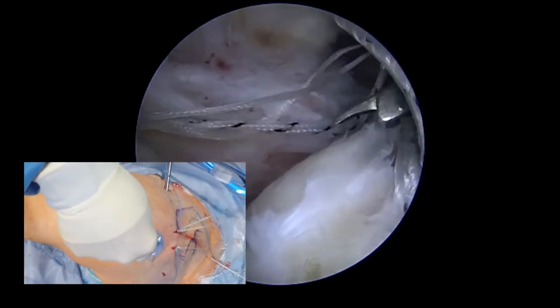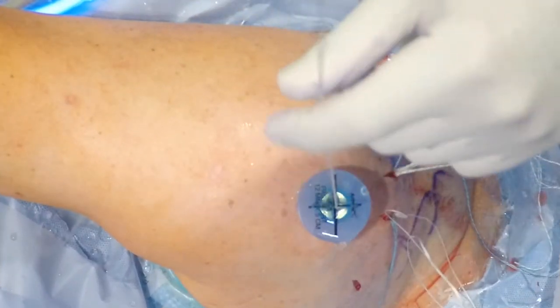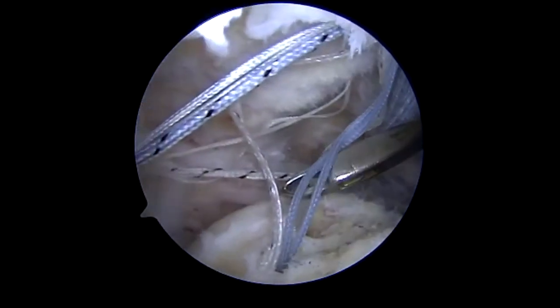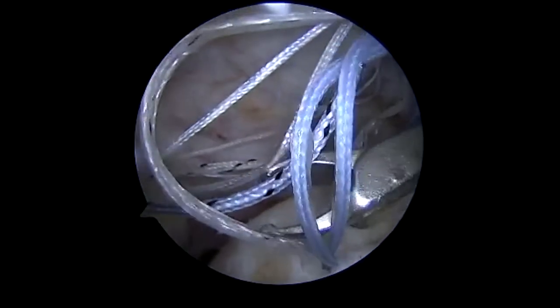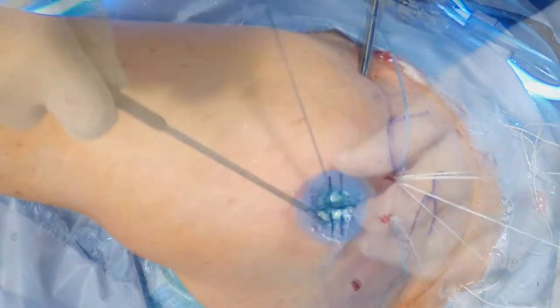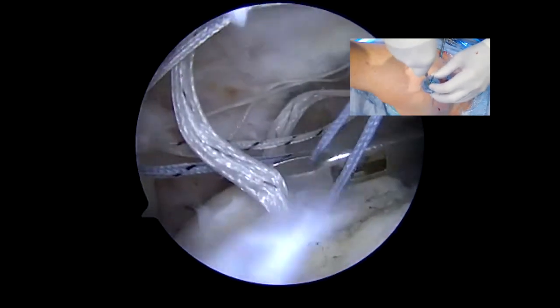The first one will be brought through the more anterior medial quadrant. Now we're going for the second shuttling stitch. It's important to keep the sutures well organized, as the latter part of the procedure will depend completely upon this. Now we're bringing the fiber wire tape sutures out the more lateral quadrant.